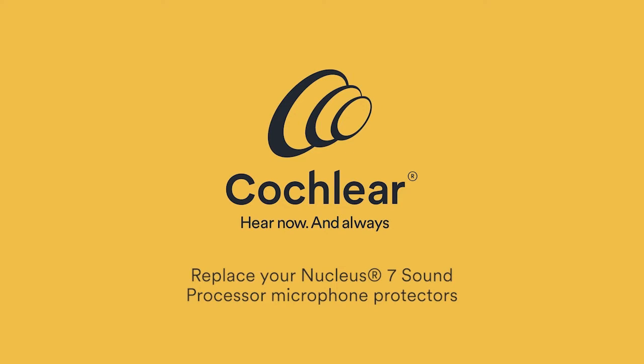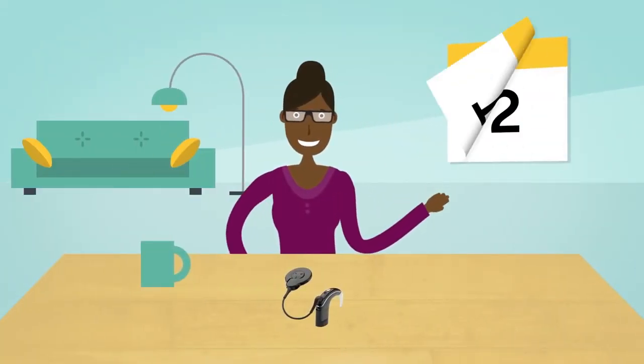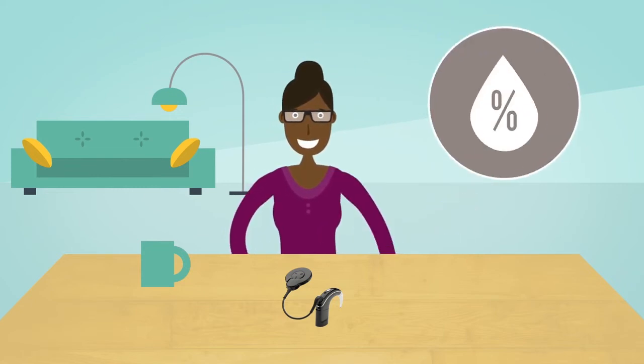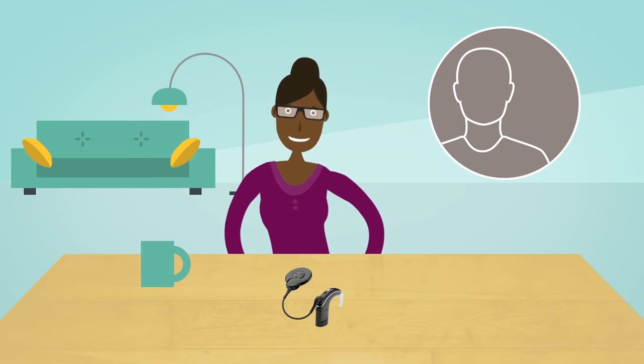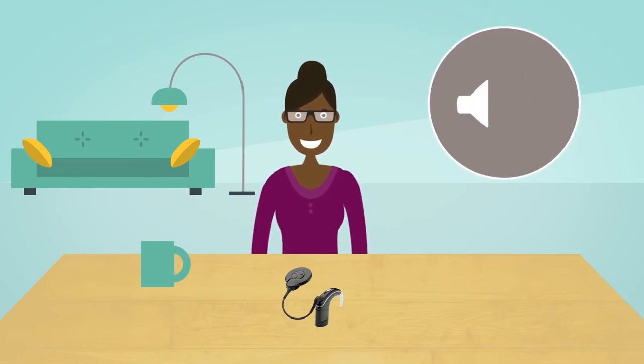You should replace your Cochlear Nucleus 7 sound processor's microphone protectors every three months, or sooner if you live in a high humidity environment, perspire frequently, or notice degradation in sound quality.